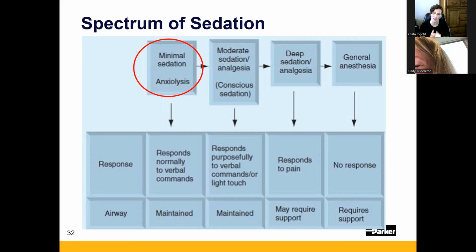And it's actually used all over the hospital for IV starts and catheter placements. And that is just simply because it has a vasodilation effect. It's not a true vasodilator, but what happens is ultimately you've got a patient that knows they're a hard stick. They're constricted because they're anxious about this. If you administer nitrous, it takes away that anxiety, allows them to relax. When they relax, they stop constricting, and then all of a sudden the veins that weren't there are there because they stopped constricting. Okay, so it's not a true vasodilator, but know that it is used all over the hospital for that purpose, right? So lots of uses outside of just straightforward labor contraction pains.